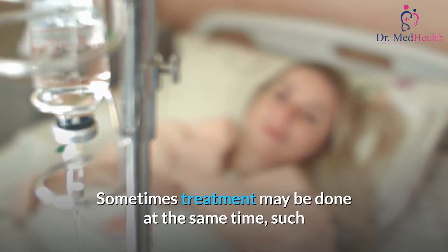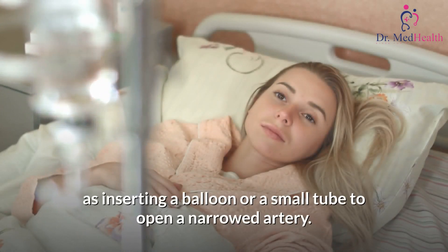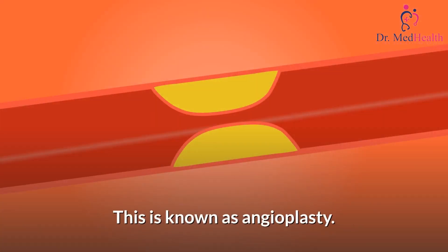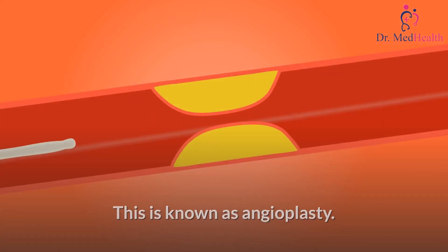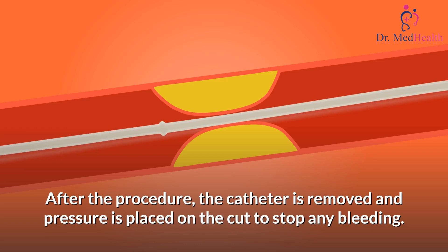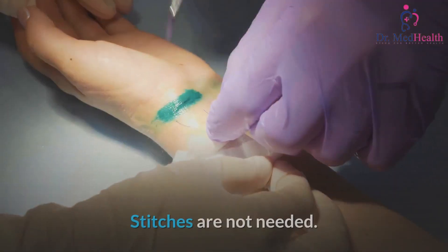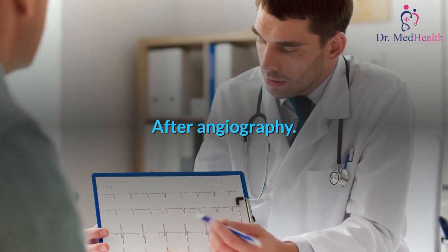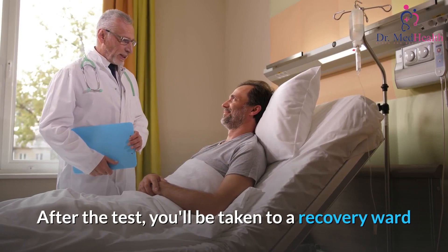A series of x-rays are taken as the dye flows through your blood vessels. Sometimes treatment may be done at the same time, such as inserting a balloon or a small tube to open a narrowed artery — this is known as angioplasty. After the procedure, the catheter is removed and pressure is placed on the cut to stop any bleeding. Stitches are not needed.